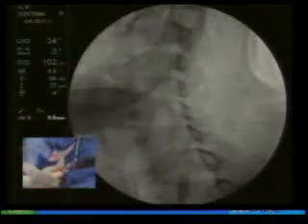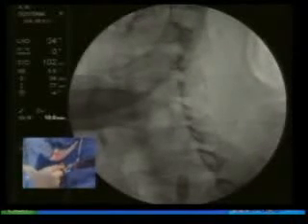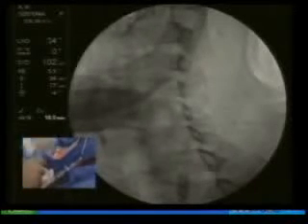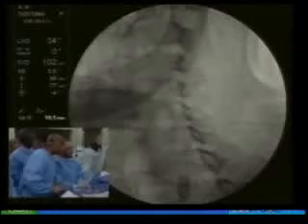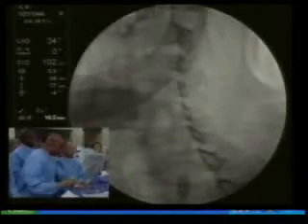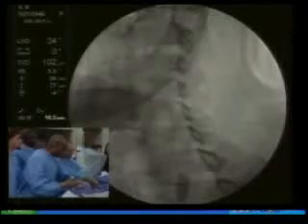Stop. No. So I think it's obvious that you don't see the external balloon with it. Are you sure the balloon's not inflated right now? You need to make sure that the balloon is actually inflated before you proceed. Yeah, I see it now. Can you see the external balloon, Chris? I think so. Yeah, the thing at the bottom there. And you see it looks like it may have a little air in the balloon. No, he's talking about the external, I think.